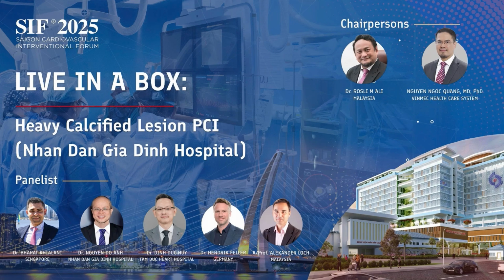So actually, in this case, you put the 3.5 stent from the LAD to the left main, or just at the ostium of the LAD? We deployed two stents, one 3.0 in the proximal to mid-LAD and one 3.5 overlapping stent from the ostium left main to LAD, and kissing dilatation was done at the left main at 4.0 by 22 atmospheres, because by the MLA we see the diameter of the left main is more than 4.2 millimeter.